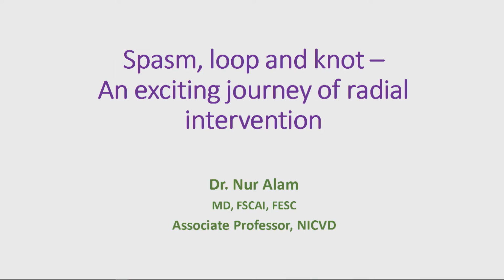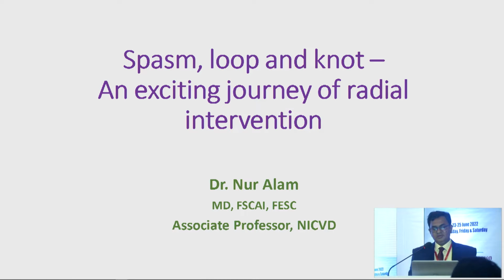So my topic is spasm, loop and knot, an exciting journey of radial intervention. As all of you who are doing radial procedures, day to day you have to face this type of problem. I will show a few cases regarding this.